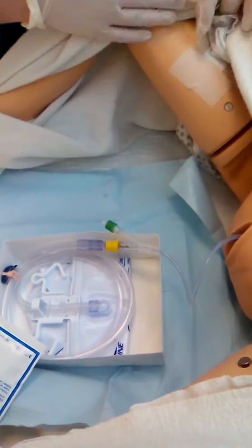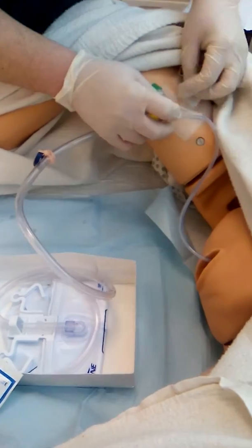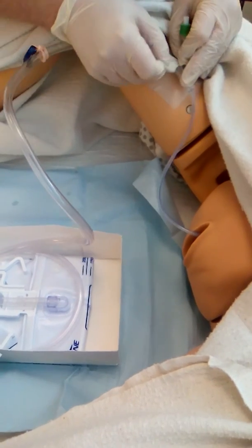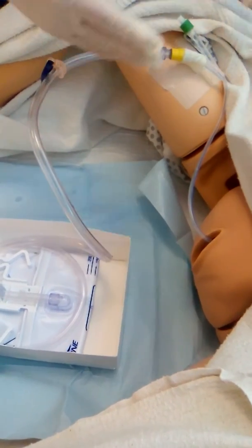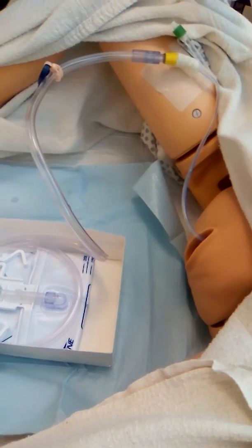And I will attach the catheter to the leg strap, making sure that there is no tension or restrictions that would be putting tension on it.